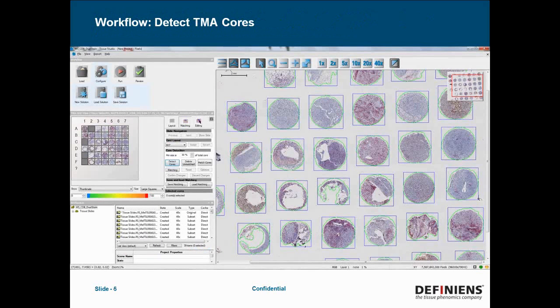At this point, I wanted to take you through a typical workflow for a project such as this. In the software, we're able to handle tissue microarrays via our grid view. This allows setting up a layout for your TMA in terms of number of columns and rows, as well as defined rows or columns that are blanks. Then you can automatically detect the cores — the tissue cores are detected in the green outline, and it automatically places them in the correct location of the TMA grid.